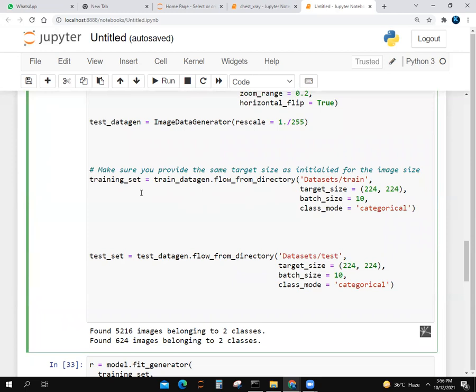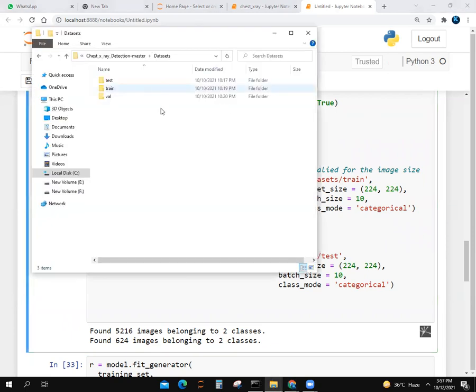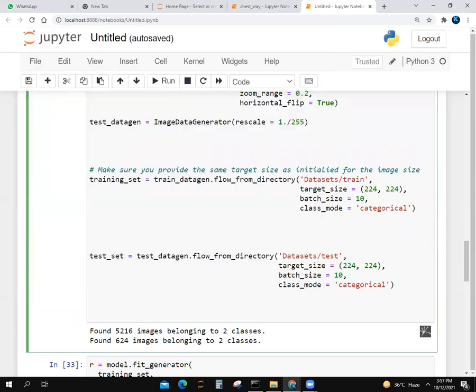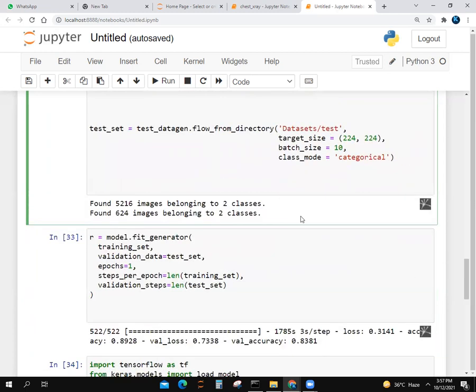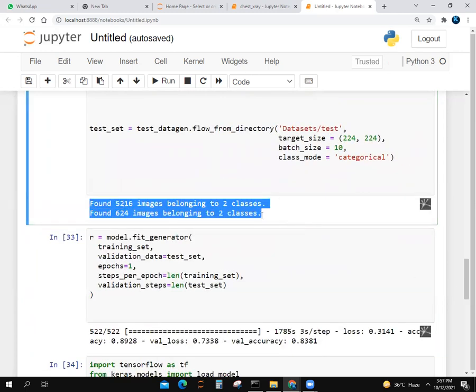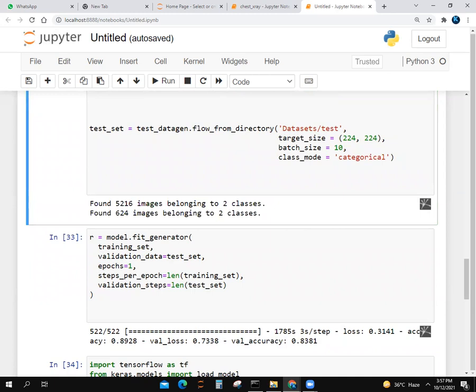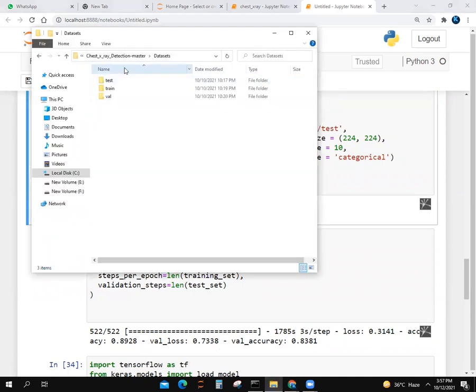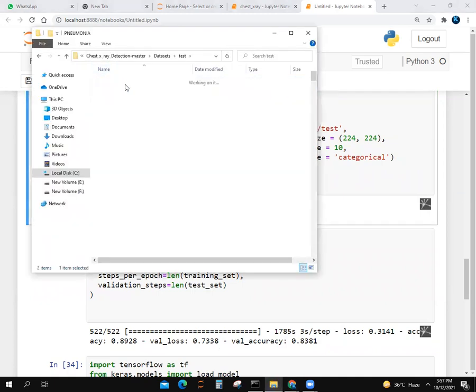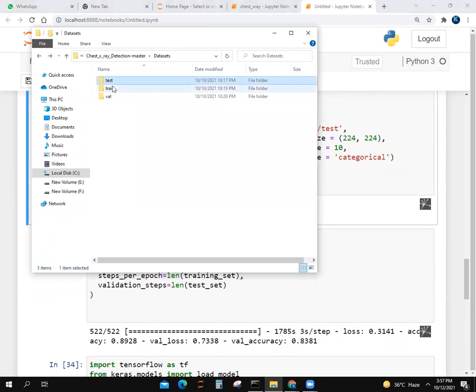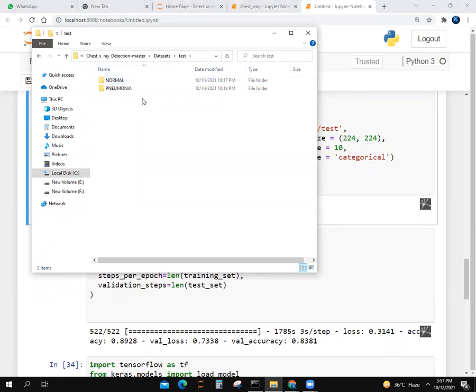We make a training set with train_data_gen.flow_from_directory. We give the URL path of the train folder and target size 224 by 224, batch_size 10, and class_mode categorical. For test set, we use the test folder. We give test folder URL, target size 224 by 224, batch_size 10, and class_mode categorical. It says class number two has these images.